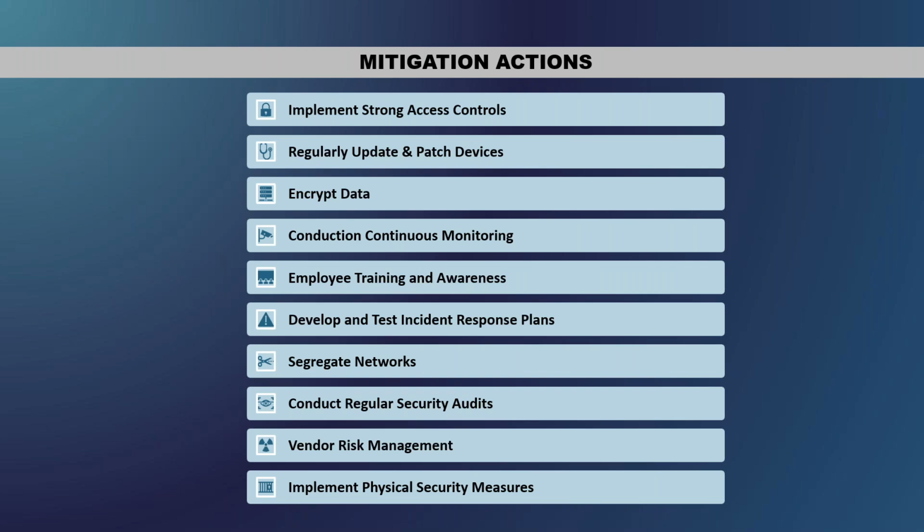And then segregating the network, making sure you employ medical device isolation architecture. So isolating those devices from the main hospital network, employing those ACLs, using firewalls and intrusion detection systems. And then conducting regular security audits.